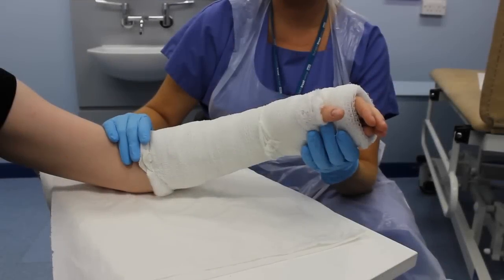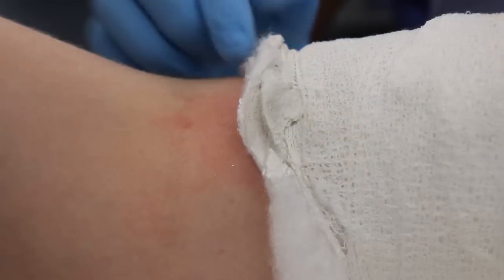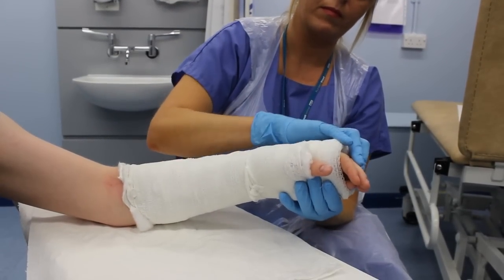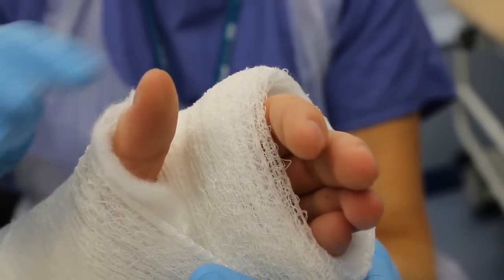Check that the length of the cast enables the person to move all joints not encased. This cast is too long and may restrict movement and cause sores — it requires trimming by an orthopedic nurse or a doctor.